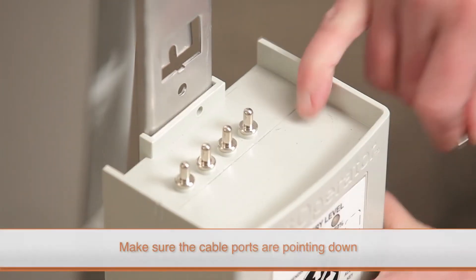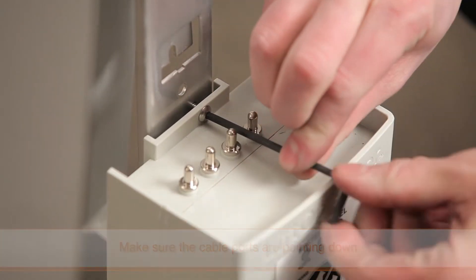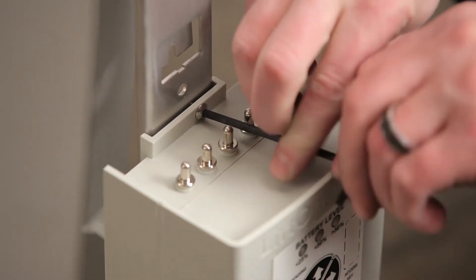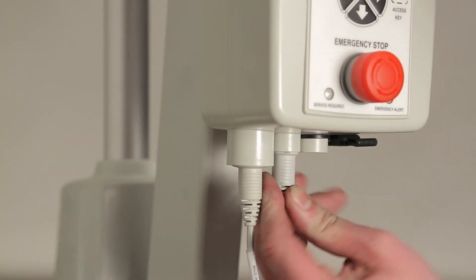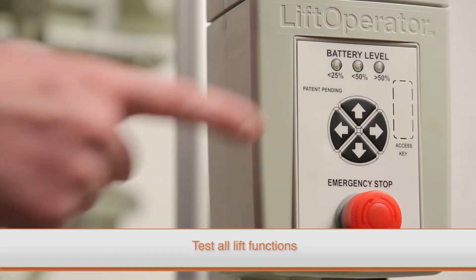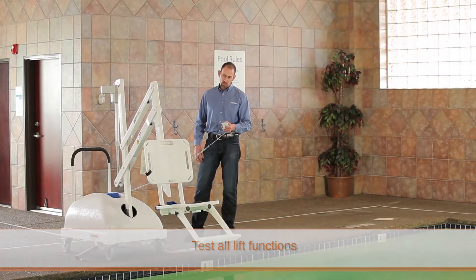Slide the control box up and off of the mounting plate. To install the new control box, place it on the mounting plate with the cable ports pointing down, then slide the box down so that it is secured by the tabs at the end of the mounting plate. Replace the torque screw on the top of the control box and securely connect all of the cables.